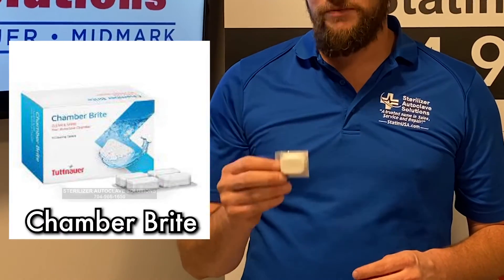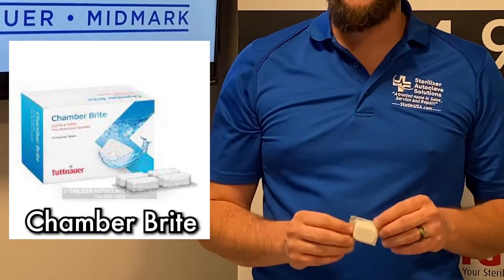Next, it comes with a Chamberbrite packet. Chamberbrite should be used on a weekly basis. This helps keep your reservoir, your chamber, and your valves clean.